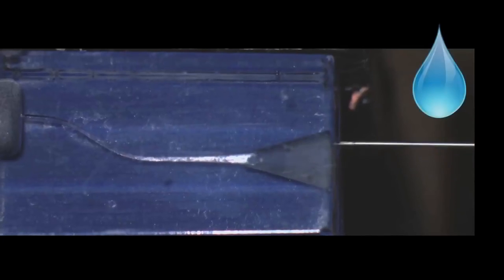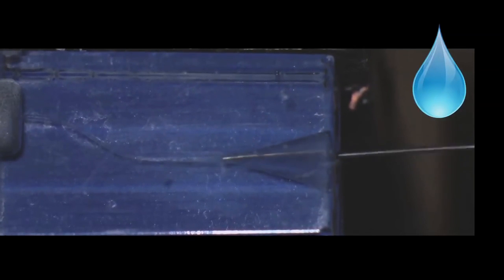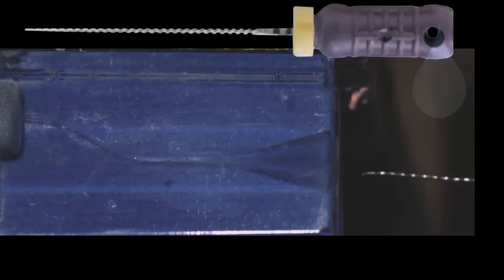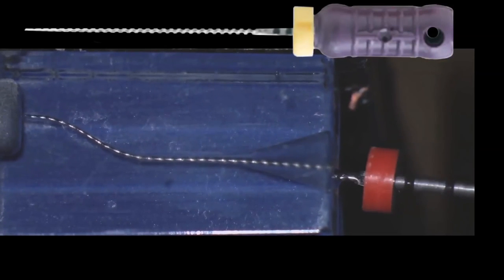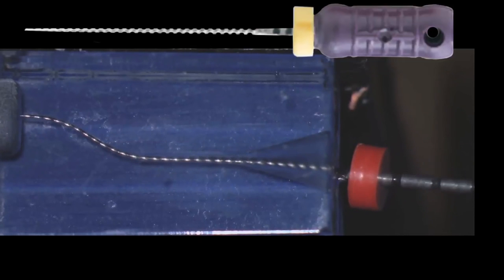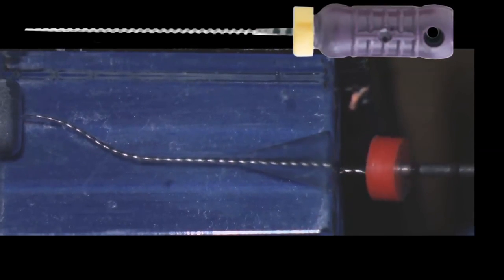Let me take you right now through a plastic block. Here we have irrigations, as I mentioned before. It's a critical part of root canal therapy. We irrigate. Now we are going to establish patency in the canals. We are going to go with a very fine instrument, a number 8 and number 10, to see that we are able to go a little bit beyond the apex. Not that much, just half a millimeter.